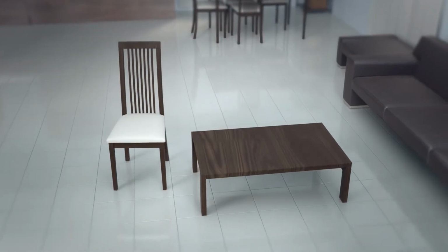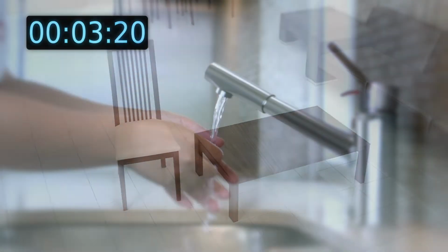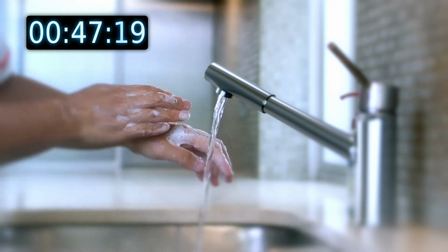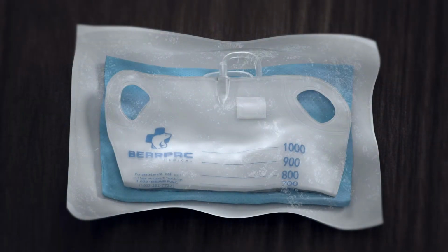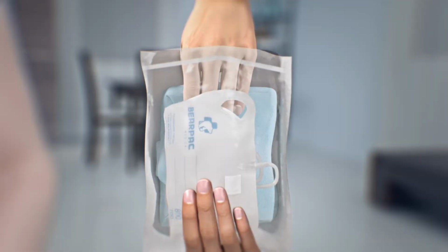In order to begin the therapy session, prepare a clean working area. Thoroughly wash your hands with soap and water for at least 1 minute. Open the pouch containing the disposable collection kit. Remove and separate the redressing kit from the drainage system.